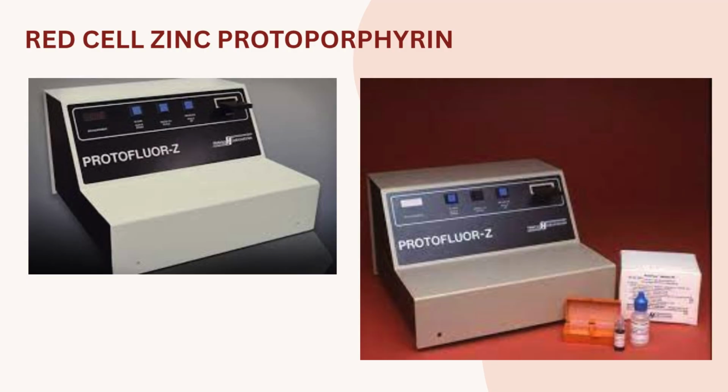After checking, you have to blank the instrument. Using a cover slip, you have to check that the cover slip to be used must be free from any dirt, scratches, or fingerprints. After blanking, you calibrate the instrument. Now you're ready to run the patient sample.